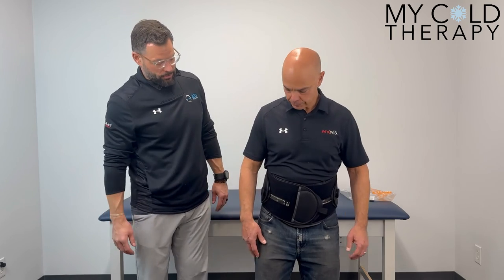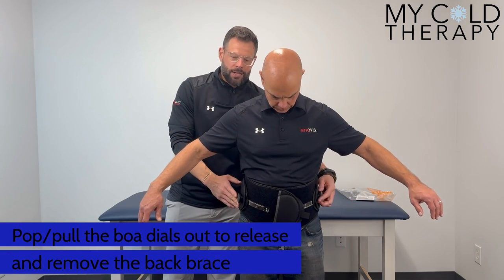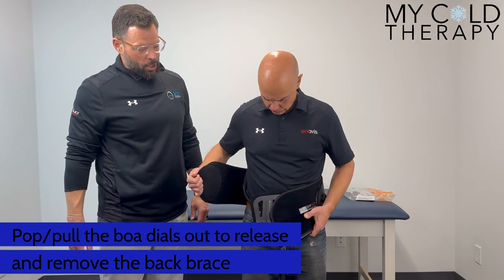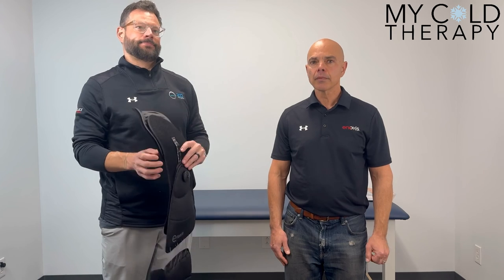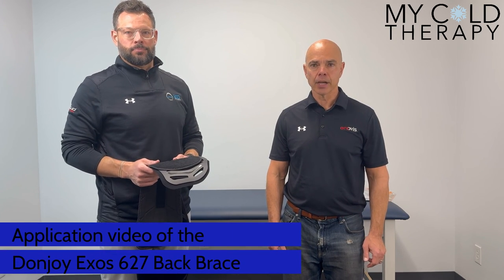To take the brace off, all we're going to do is pop both of our dials — that's going to release. Steve's going to open the brace now and as you can see, our interior panel is still velcroed in the brace. And that is the 627 Exos Back Brace by Donjoy.